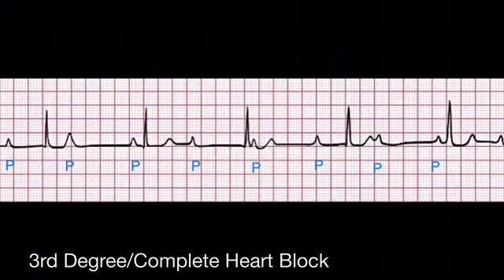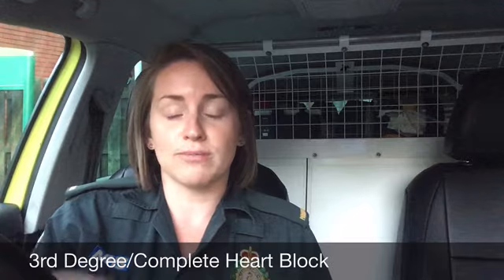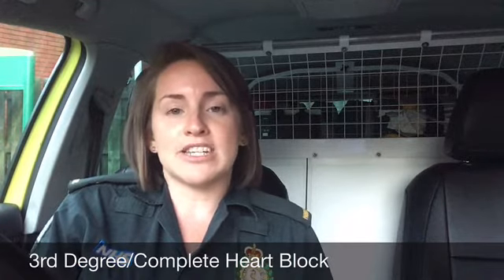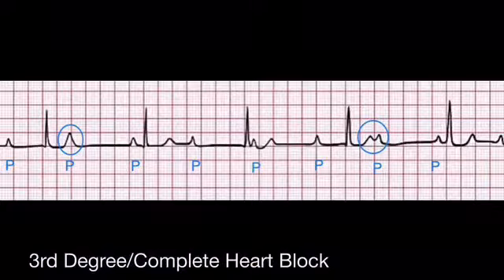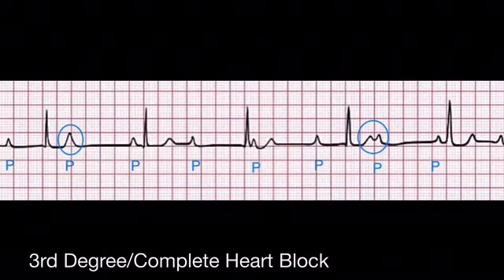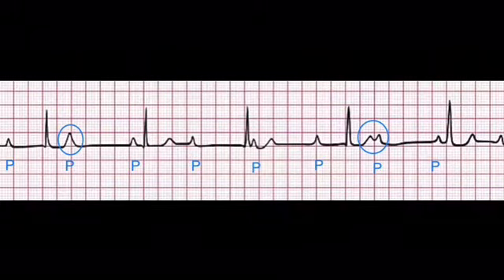Something important to notice when you're marking out and looking at this long rhythm strip is a misshapen or odd T wave. If you see misshapen T waves, or something that just doesn't look right, you can have a P wave hidden underneath it. So if one T wave out of 4 or 5 looks a bit odd, misshapen, or lumpy, it's more than likely a P wave hidden underneath there. So include that when you're counting them out. Typically, because we're down near the ventricles now, you should see them in the region of about 20 to 40.